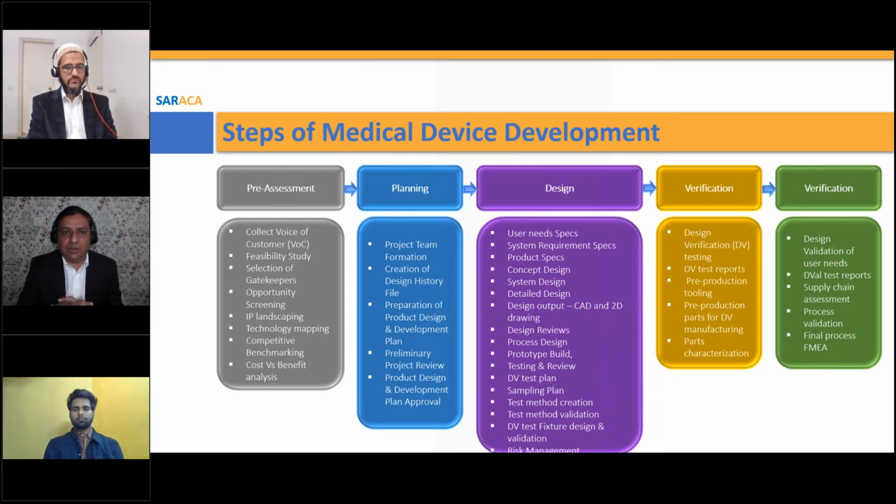It needs to be reduced to 3 or 2 based on your project team's assessment. So you need to come back and assess that. Similarly, some of the risks you might have at a lower level, but you are getting a lot of complaints. Are you coming back to your DFMEA, PFMEA, or fault tree analysis, any technique, whatever you use, and increasing that risk so that you do a good assessment?